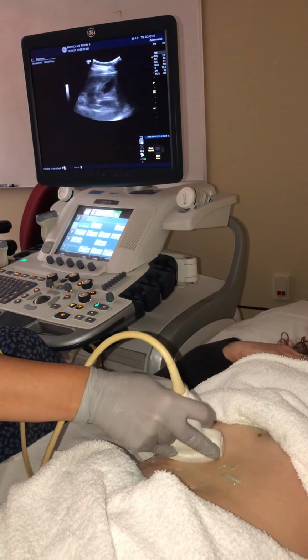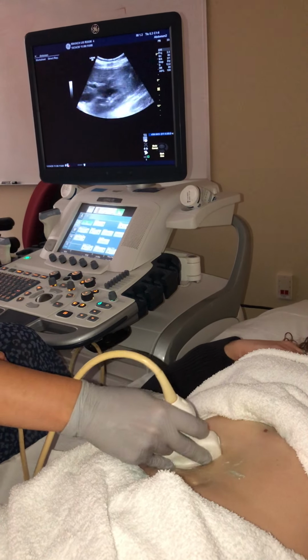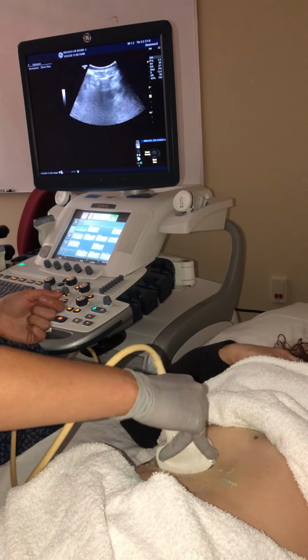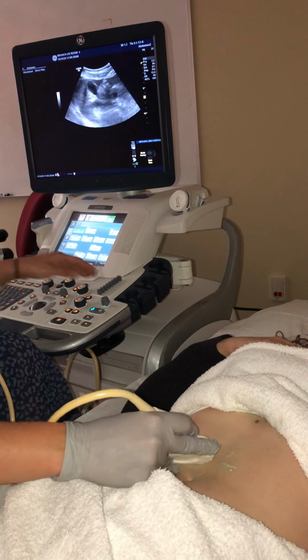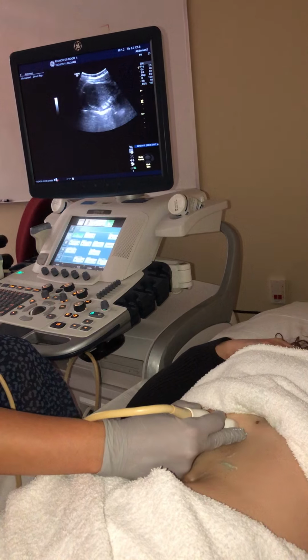So it seems a little strange that for Sag, we're pointing it towards her left shoulder, but we're really still kind of keeping it in that Sag orientation to the organ. So transverse, we're going to flip that, and we're going to do the same thing. Big breath in. We're sweeping all the way up under her ribs, up to that dome.